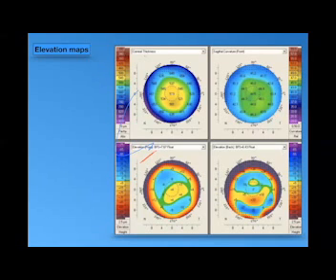But I'm asking only, Dr. Hossam, is there a difference in the elevation points between the best fit sphere and the ellipsoid? I think the numbers differ between the two. Yes, of course there is a difference between the best fit sphere and the ellipsoid fit sphere map. But the commonly used is the best fit sphere, which is easier and simpler than the ellipsoid map, which is used in case of a high astigmatism.